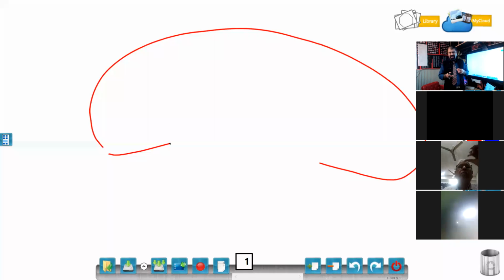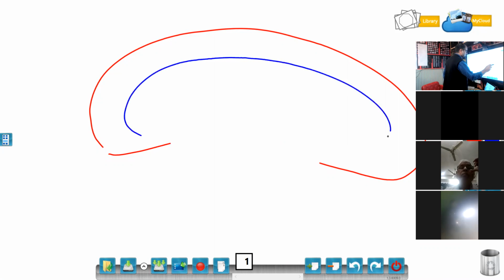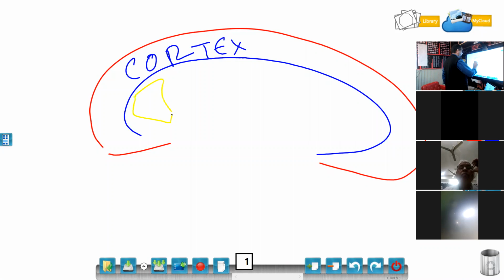So the question is, are calculi in the cortex, in the medulla, or in the collecting system? Post in the comment boxes now. Sultan, show me the comment box. Now, this is the cortex. Collecting system. Now see, this is the cortex. These are the pyramids over here.